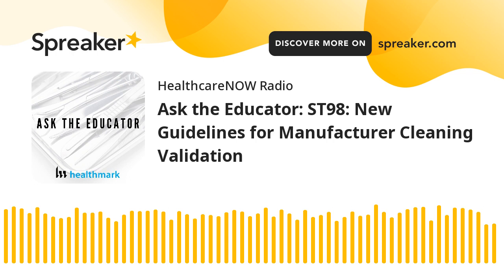Yeah. So just to get right into it, a quick introduction to what ST98 is and who it's intended for. Yeah, good question. And it was interesting that, not surprisingly, in the webinar we had a lot of people from healthcare facilities, and so I had a lot of questions like that. But ST98 really is meant for the device manufacturers. And what's different about ST98 than any other document we've had before this is it's actually focused on what the manufacturer is required to do to validate that the instructions they're providing to the end user result in a clean instrument.